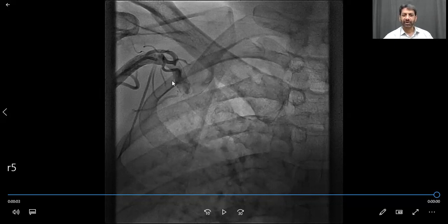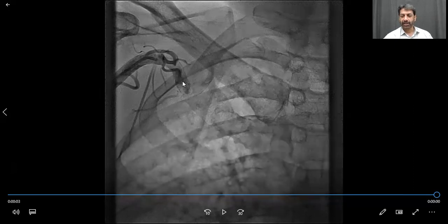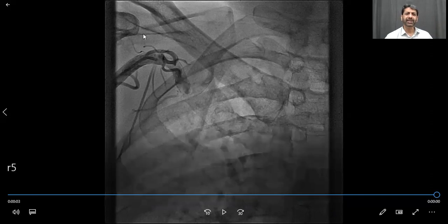So very frequently in radial, you expect resistance at any place, even at the elbow or anywhere. So advance very delicately, and if you find resistance, don't push it, never ever. That's the golden rule. To overcome that resistance, first take out your guide wire and take an injection.